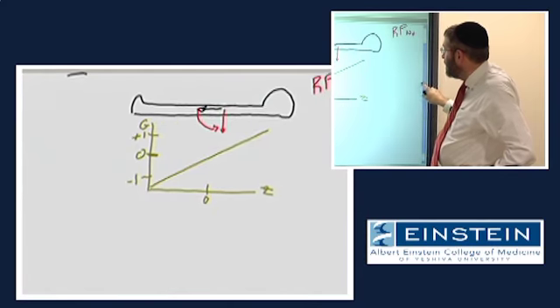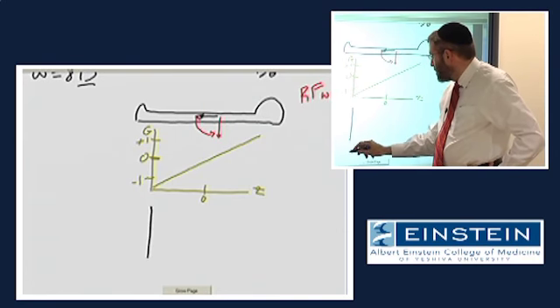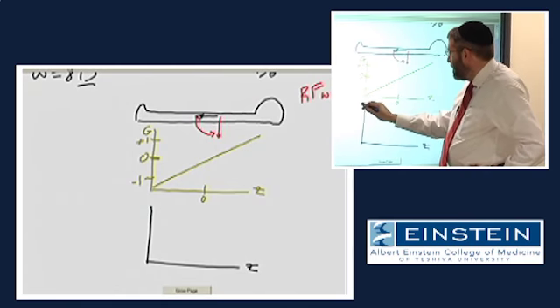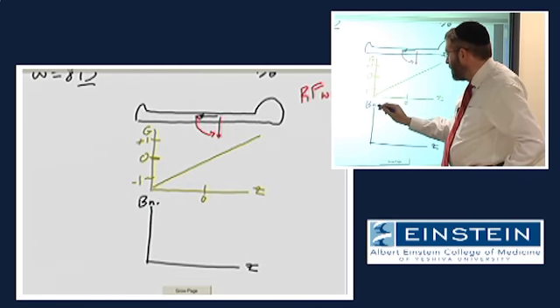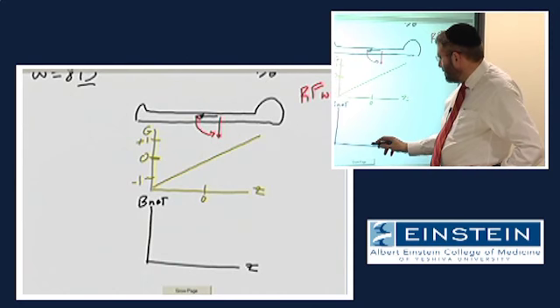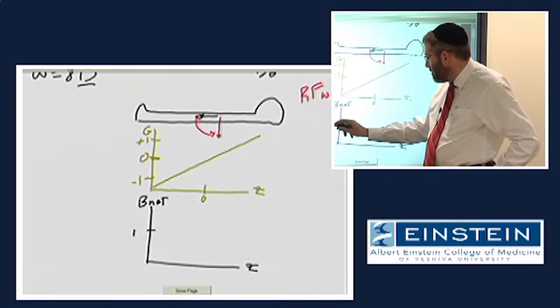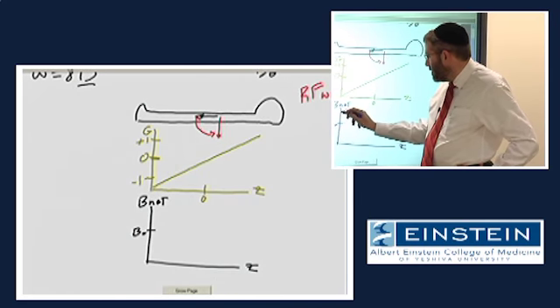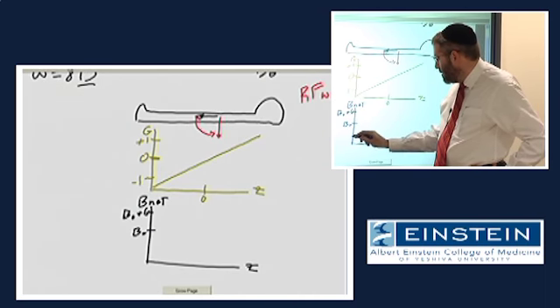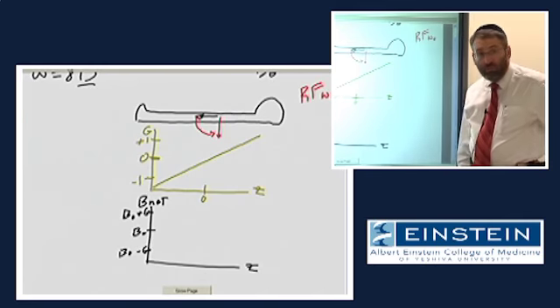If we take that into account, we can actually plot, again along the z direction, the net magnetic field strength, which, let's say, is going to range from B0 at isocenter to B0 plus G and B0 minus G. Okay.